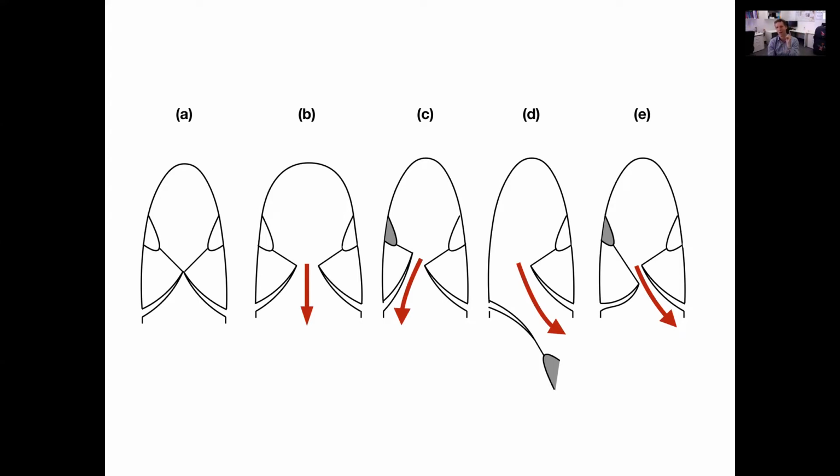D and E are flail for D, prolapse for E. Flail, D, because the leaflet tip is pointing down towards the left atrium. E, the leaflet tip is still pointing up towards the left ventricle. Classically, it goes past the annulus, so I can probably draw this cartoon a little better, and maybe that should be more of a U shape going past that annulus. That's more the classic prolapse. So maybe those cartoons could be done better in retrospect.